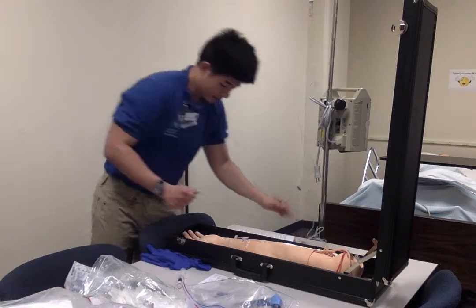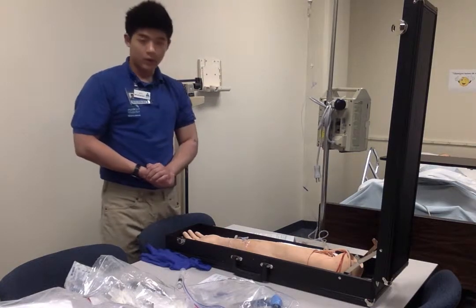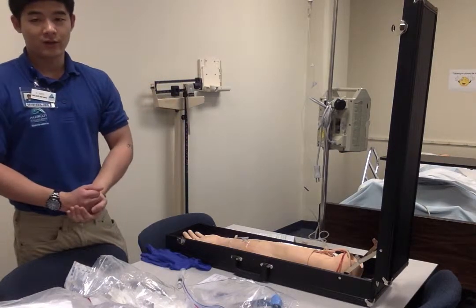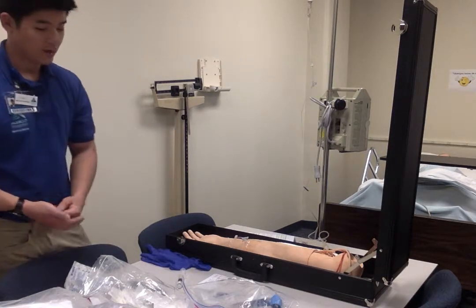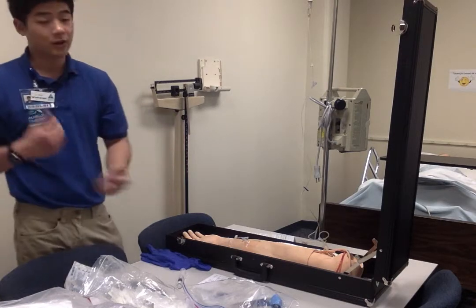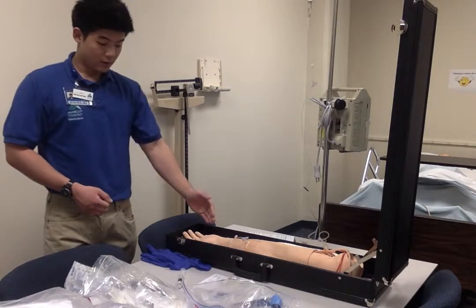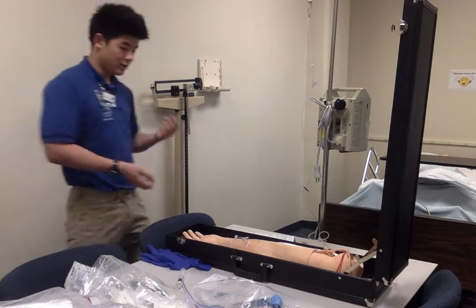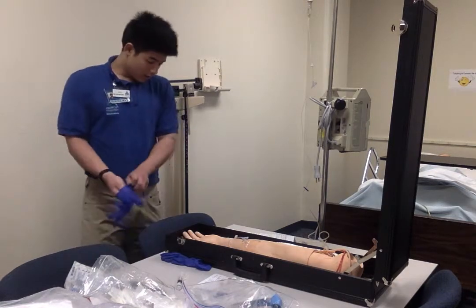And with all this, I'm going to go up to my patient, knock on the door, go in, introduce myself, and tell him that the procedure is going to be vancomycin antibiotics through IV, and the side effects. I check if this person has any allergies, and always check the two identifications, which is the name and birth date, most commonly.